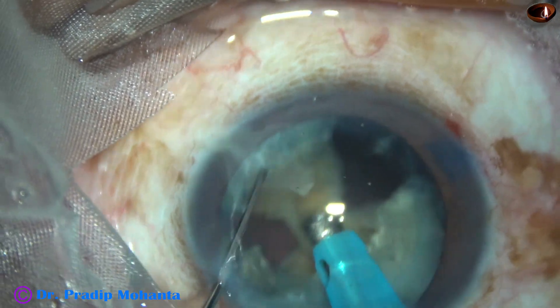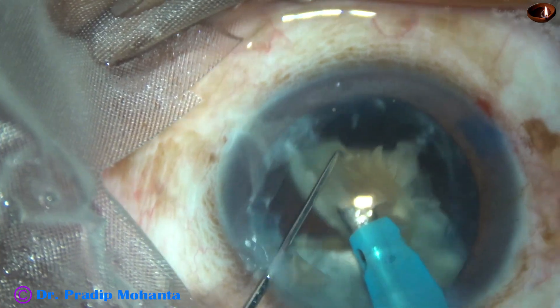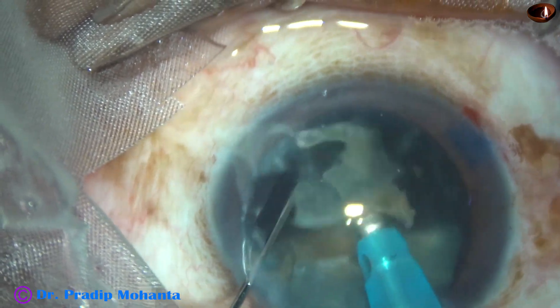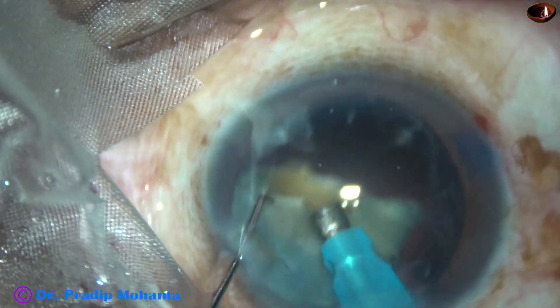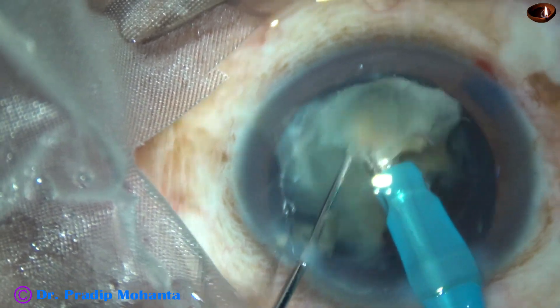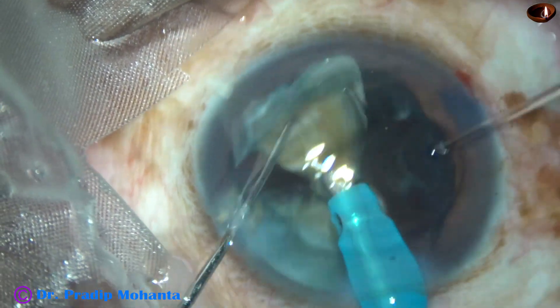Ultrasonic energy from the very beginning is 80% in continuous mode. Flow rate is 45 ml per minute. Vacuum is 450 mm of mercury. This is a small part of the nucleus — it is divided into two pieces, and they are emulsified and removed.